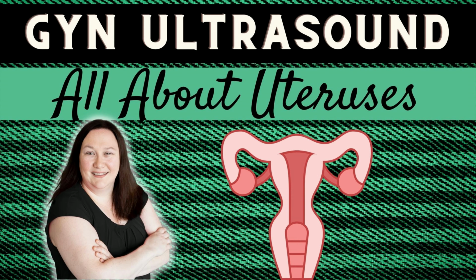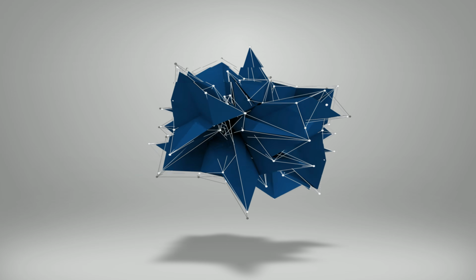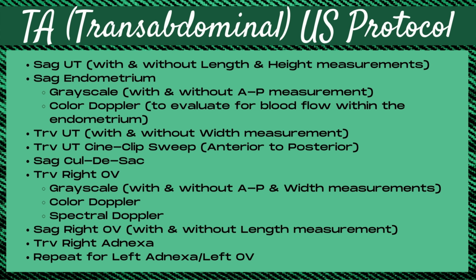Let's ultrasound. On today's edition of GYN Ultrasound, it's all about uteruses. So first, let's start with the protocol.